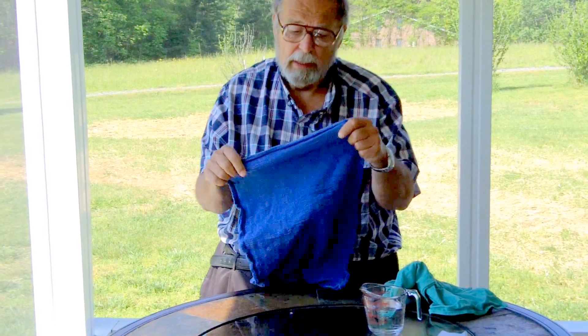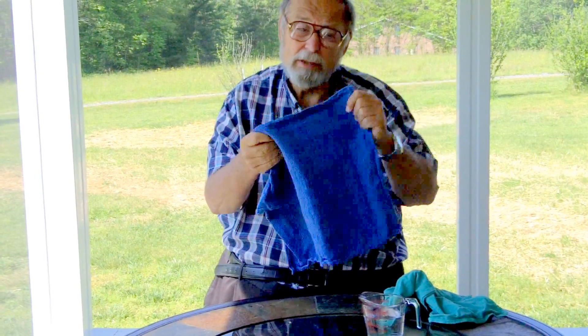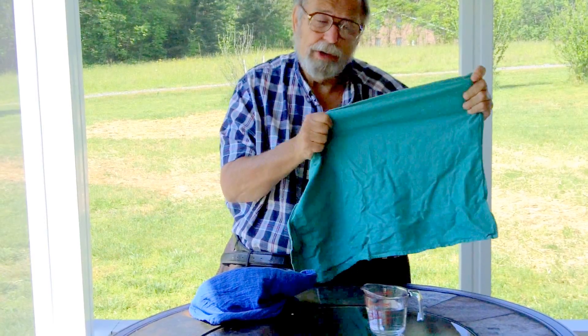Our blue surgical towel is a little bit thinner — if you hold it up, you can actually see light through it. The green surgical towel is a thicker weave, so when you hold it up you can't see anything through it.